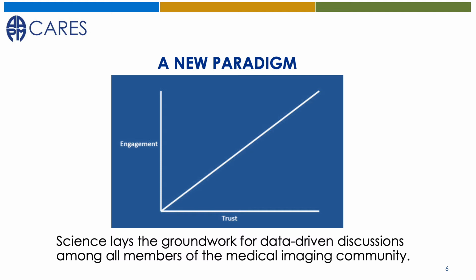We are all in agreement about the as low as reasonably achievable, or ALARA principle, and this change in clinical practice does not undermine the fact that we are all responsible for ensuring our patients receive the lowest possible radiation dose in combination with the creation of an optimal diagnostic image.